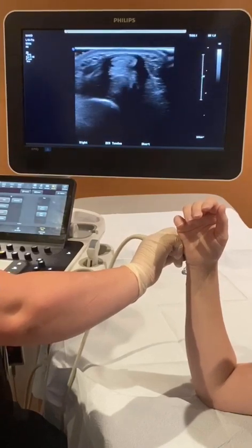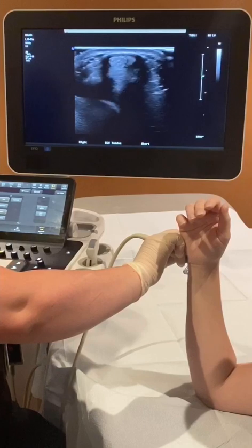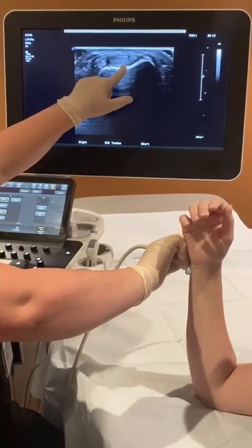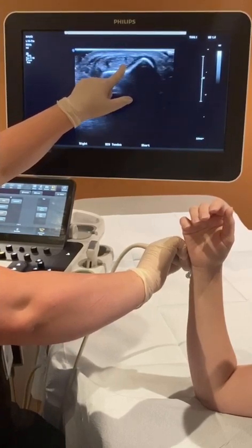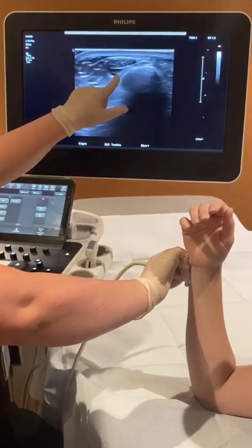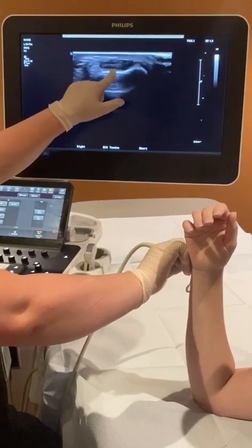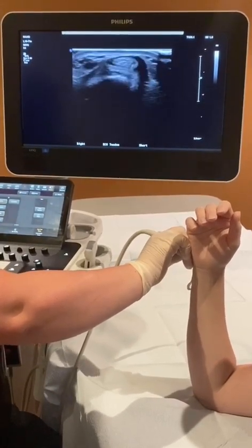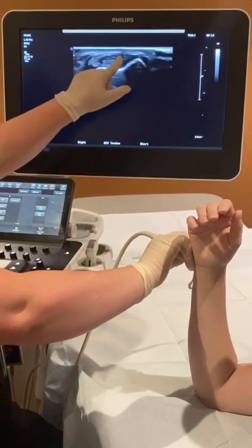First, you're going to sweep through the tendon looking for any obvious abnormalities. As I scan proximal, I had to tilt the probe distal to eliminate anisotropy. That's just the myotendinous junction right there — that's not fluid. There were no obvious abnormalities of the tendon besides a little bit of a hypoechoic defect right there.